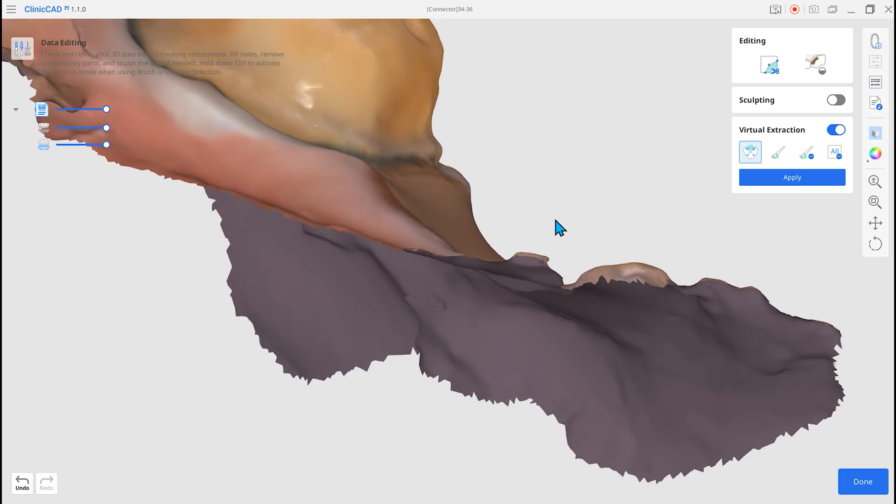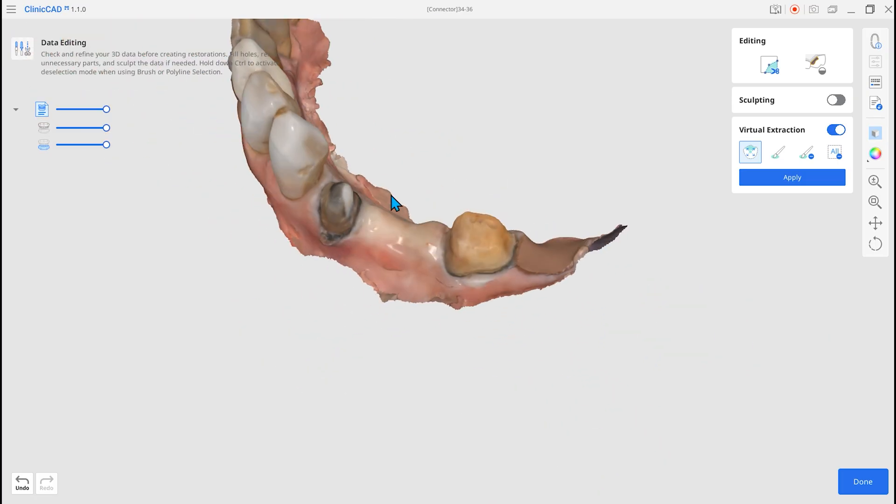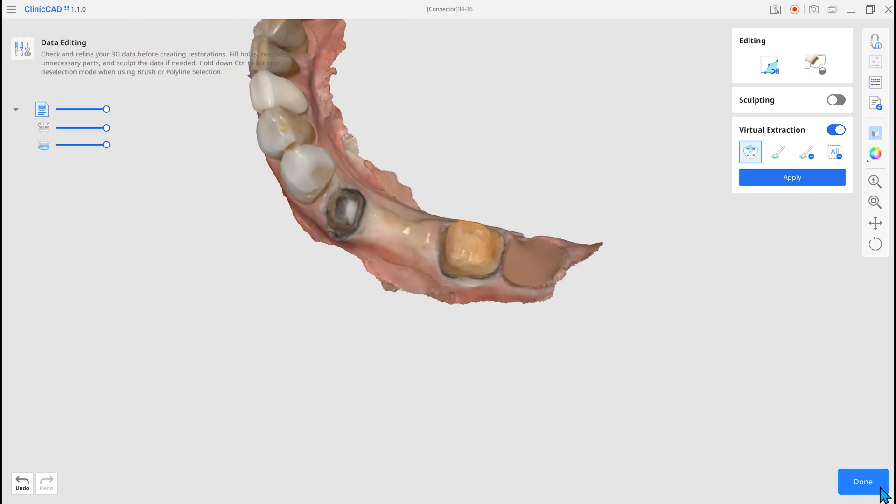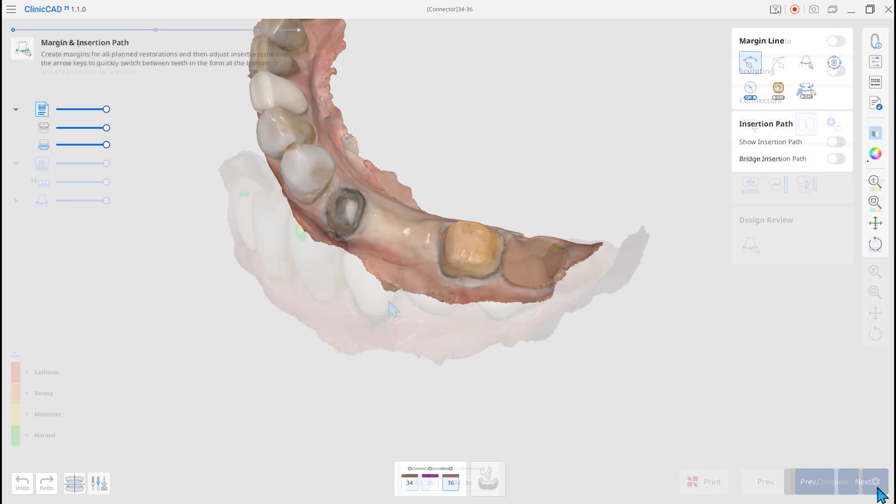With Virtual Extraction, you can simulate the post-extraction result and establish an optimal restorative plan.